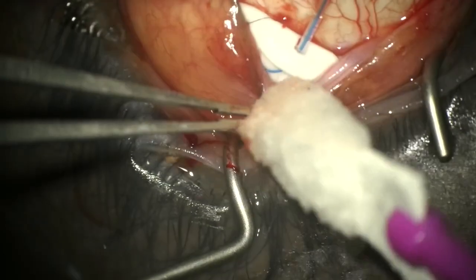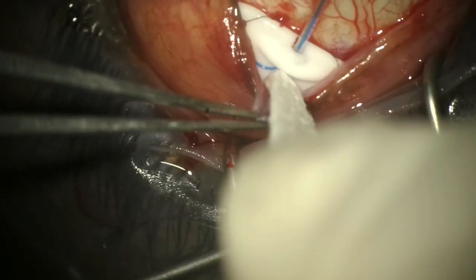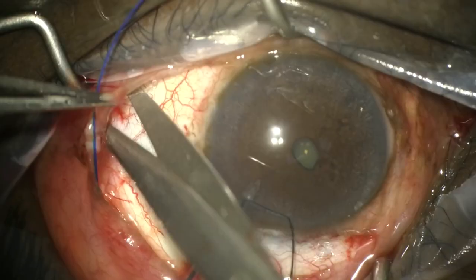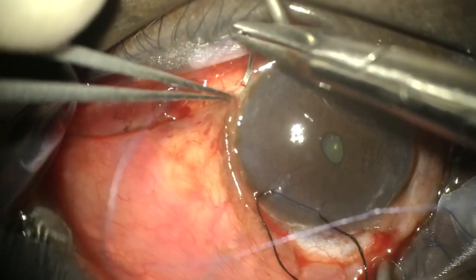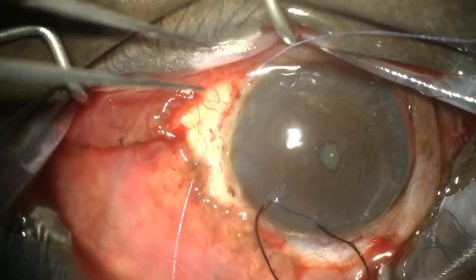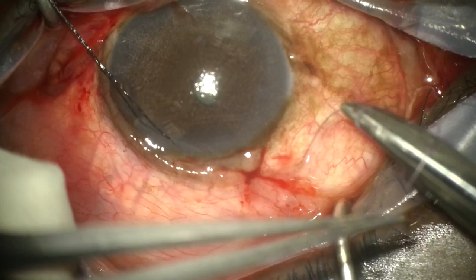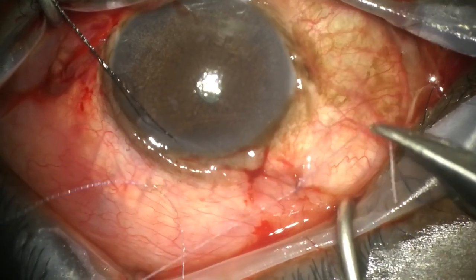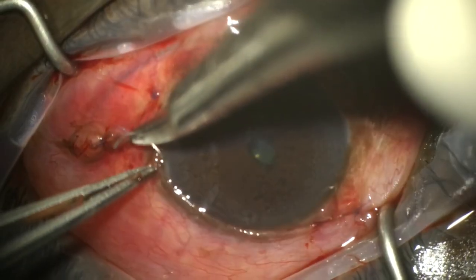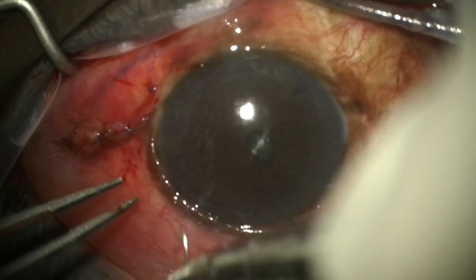We now check the flow, which is the most important step, and we have some flow present. This is what we're aiming for, essentially allowing this to work like a pore tube with early flow to control pressure. We secure the conjunctiva with Vicryl sutures and that completes the case. The patient had a very good outcome at two months with a stable pressure of 10 millimeters of mercury.